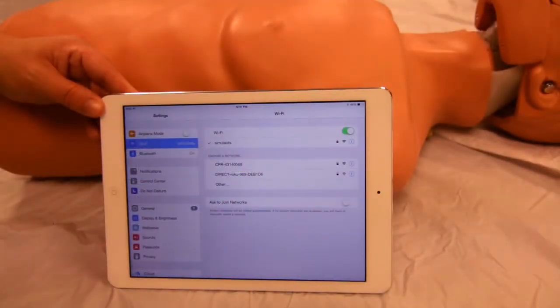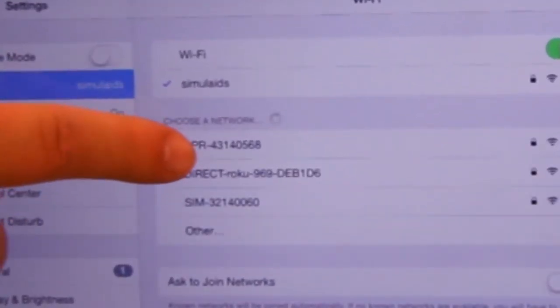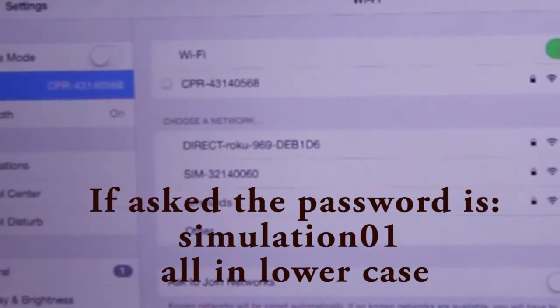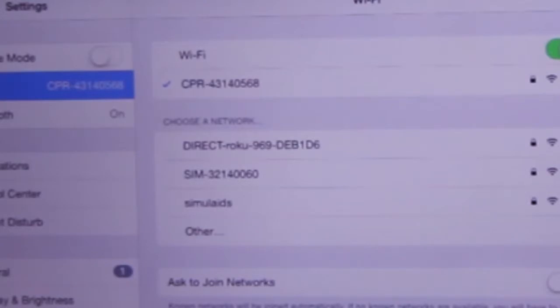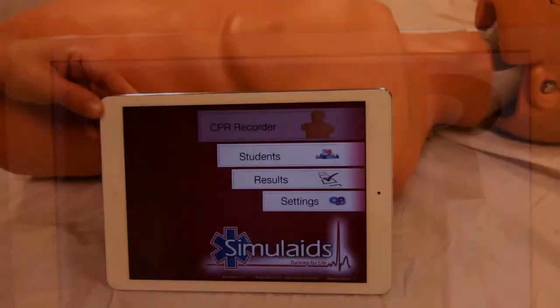The CPR recorder will appear. Select the CPR recorder, then exit settings, go to the CPR recorder app, and start it.